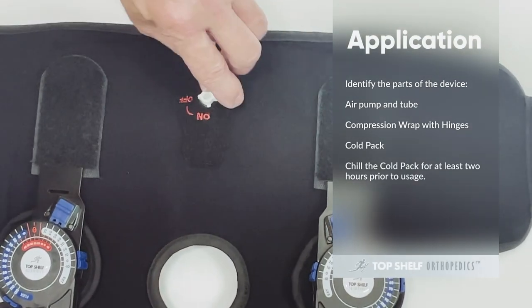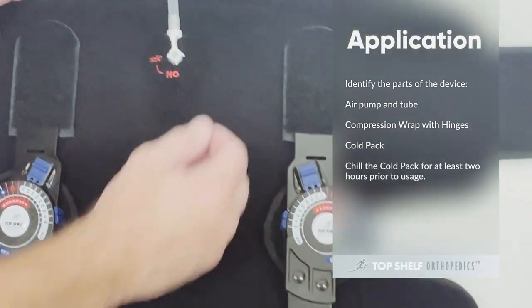Identify the parts of the device: air pump and tube, compression wrap with hinges, cold pack.